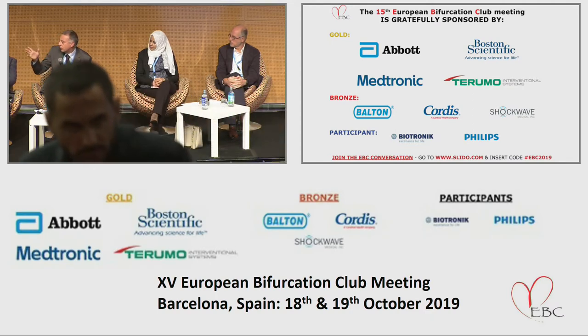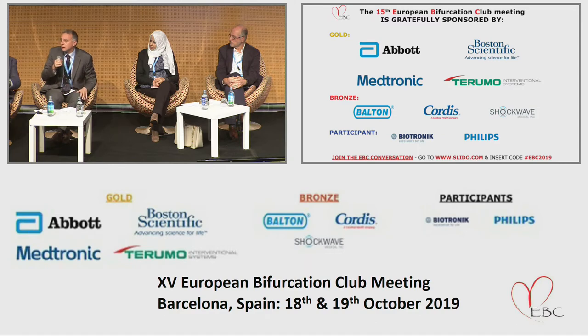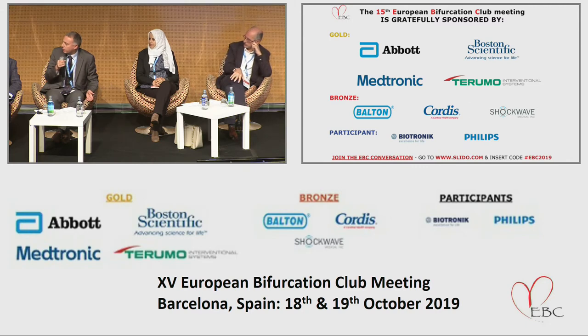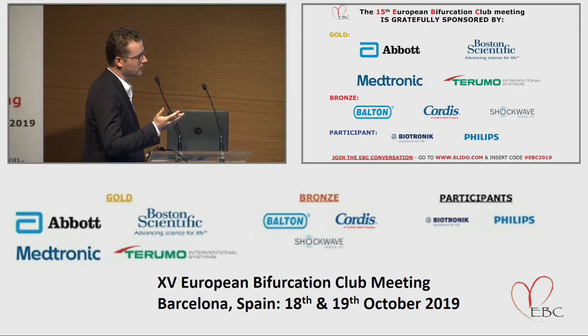Yeah. And just a small comment, in the interest of time, I captured that the jailed guide wire was used in half of the patients, something like that. 50%. Yeah, in fact, is this part of your technique, or does it mean just that they are false bifurcations? No, it was a center training, so we have five centers, and two of them systematically realize a jailing wire, and three others not. So it's just a local practice, not in correlation with the anatomy.